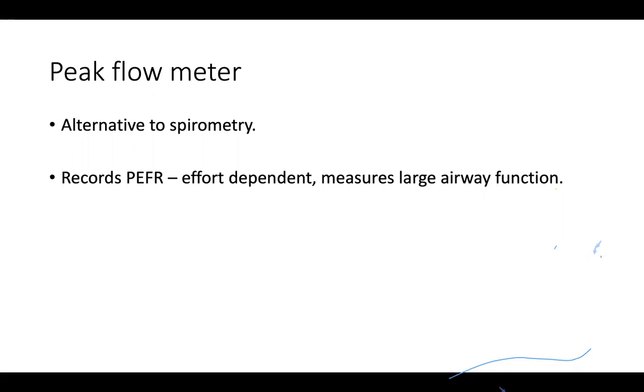The other method to determine function, if you have a ventilated child with Guillain-Barré syndrome where you are thinking about weaning the child, is to use USG, where you look at the diaphragmatic movement. You can use the sonography machine to look at the movement of the diaphragm. And the other method is exhaled nitric oxide. If you have a child with airway inflammation, this can result in release of nitric oxide. This exhaled nitric oxide can be picked up by the computers, and this can determine the degree of inflammation.